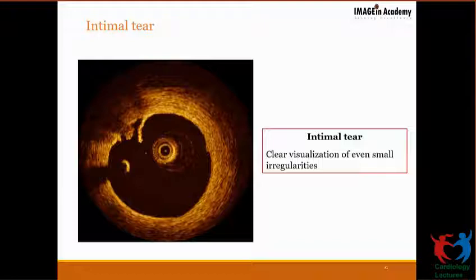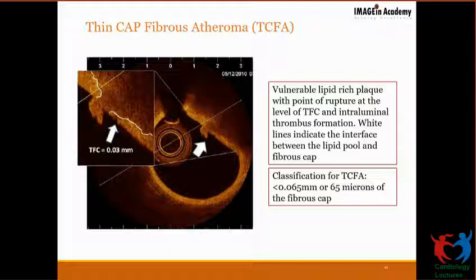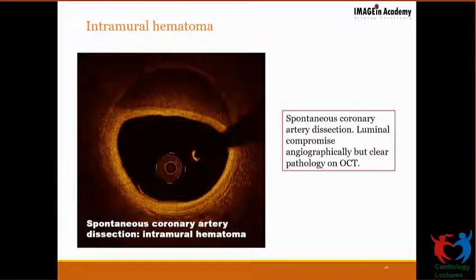This is an image of a thin cap fibroatheroma which is absolutely about to rupture, and once it ruptures, it leads to formation of thrombus over the surface. It's the lipid pool which is the inciting factor. It leads to a lot of local thrombin generation, and you will very soon have a clot formation. And as I told you, the classification is based on the thickness of the fibrous cap, whether it's 65 micron or below. You can have spontaneous dissection, and spontaneous dissections basically show intramural hematoma.